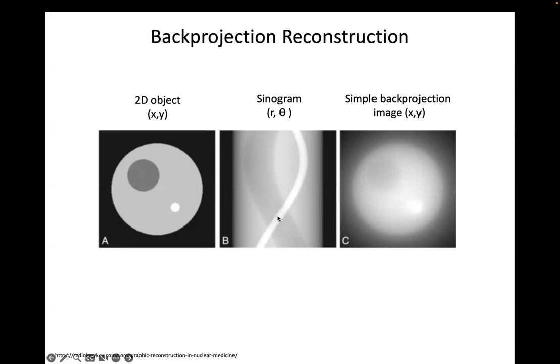And so, here where they're overlapping, right here in this P(R, theta), if I went through and said, oh, the bright source is right in the middle of the dark source here in this one row, that must be this projection that goes through that puts, excuse me, puts this right on top.